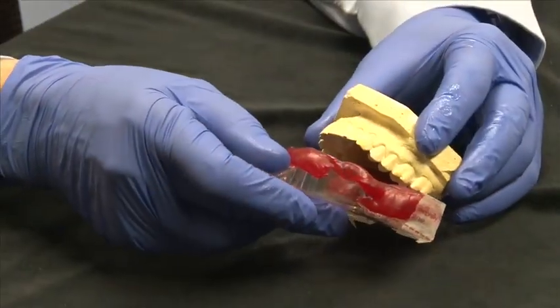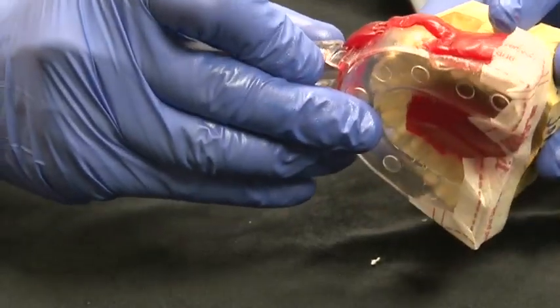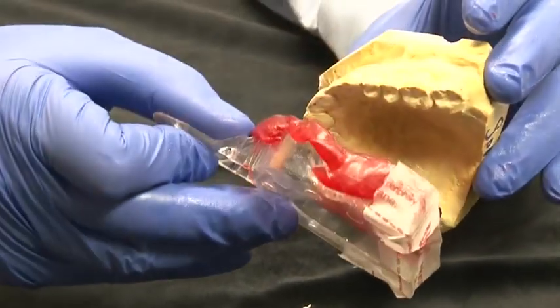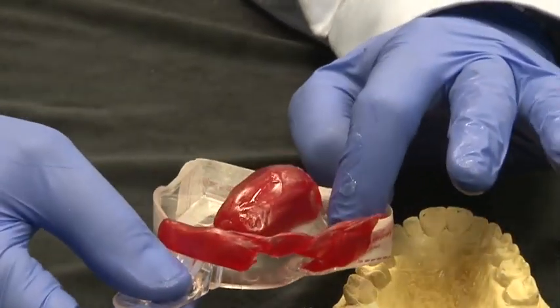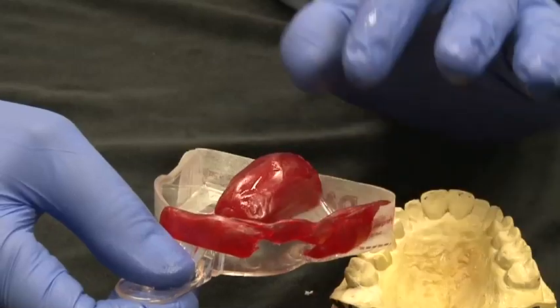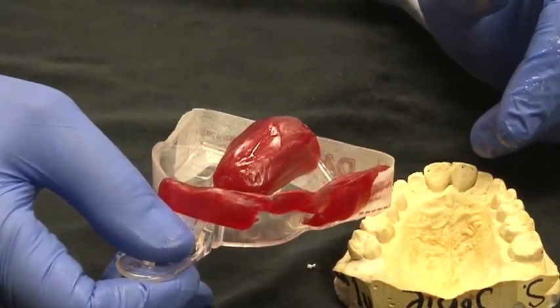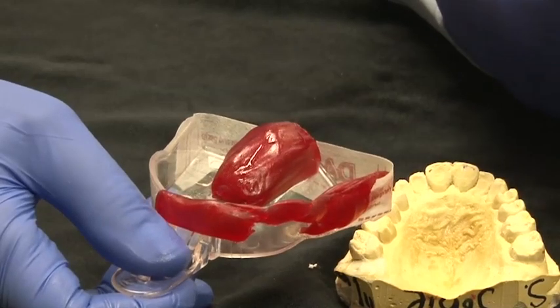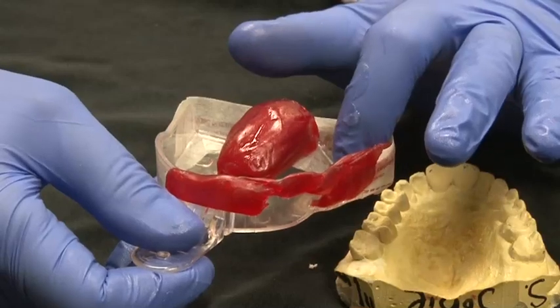If you notice, if we were seating this tray in the mouth, the distal part where the Dammit is actually really captures the distal of those second molars really well. So you have less likelihood of missing or getting bubbles or lines, pull marks in the distal portion of those second molars. It really captures that area much better. It helps to lock the distal material into the tray better.